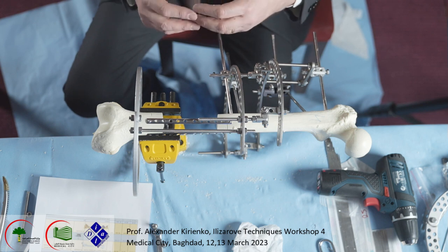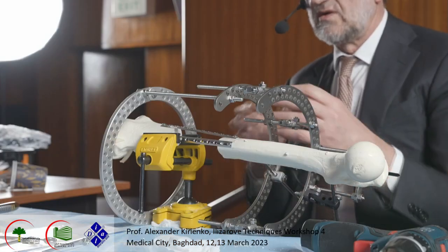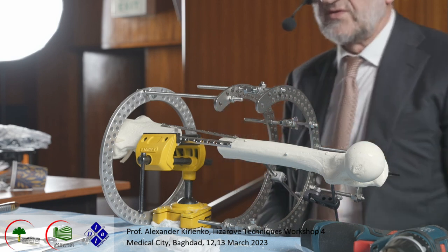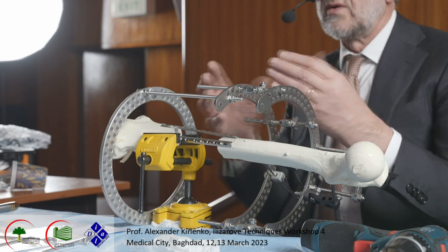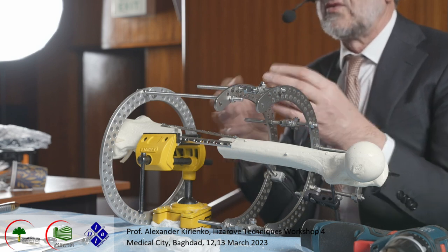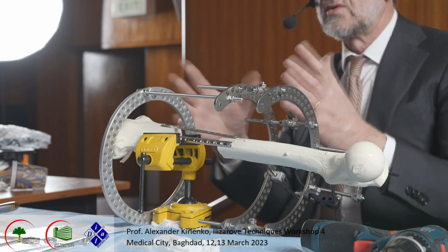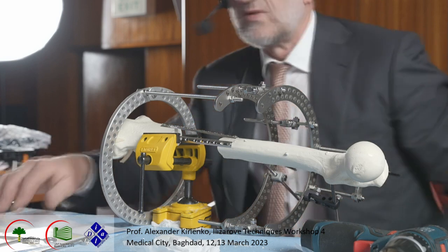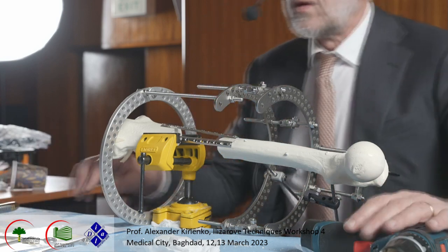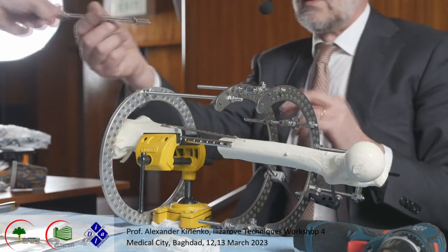We may do correction of varus, valgus, translation, and in this way you achieve good control of the docking site. Or another way, when you arrive at the docking site, if you want to do another surgery, clean it, put it in compression immediately and solve the problem. Okay, we do another rod, 200, yes.